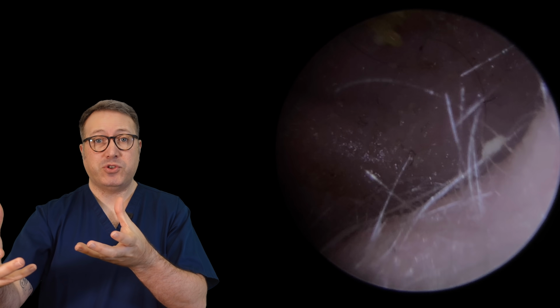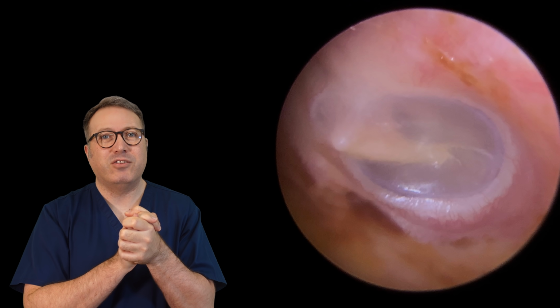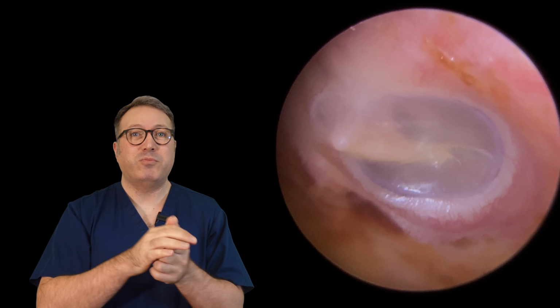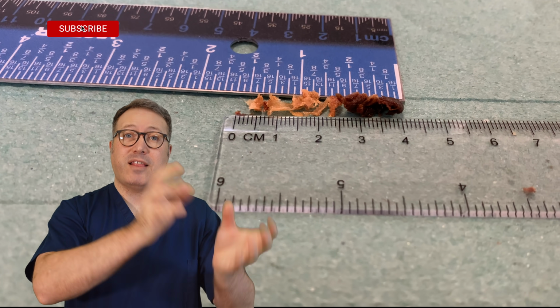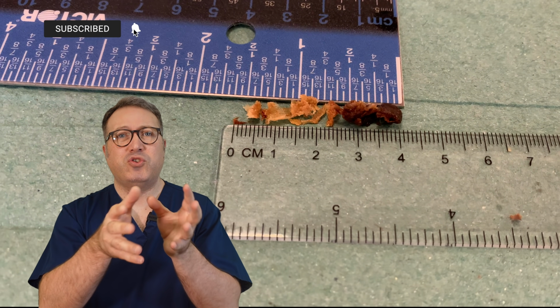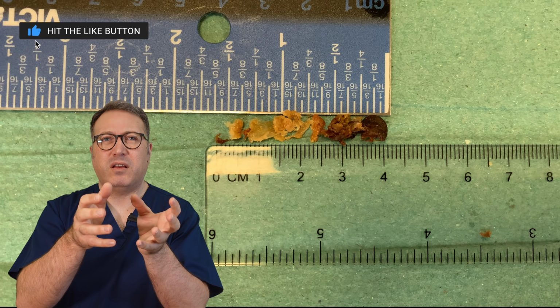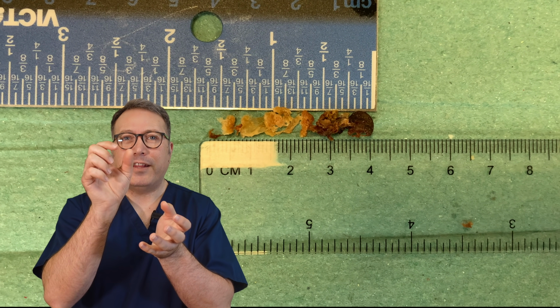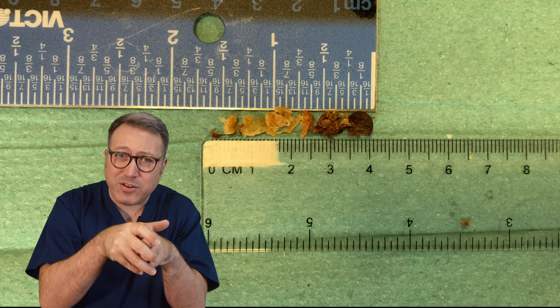That lighter material you saw just at the top, that was the dry skin. There we are, there's the ear canal looking a lot better. Eardrum looking much healthier there as well. So there we are, you can see the skin materials to the left hand side. So that's the first sort of 2.5 centimeters, which I think is about 1.25 inches, or 1 inch even. And then you've got the darker material there to the right hand side as well, which was the wax that was encased in all of that skin.